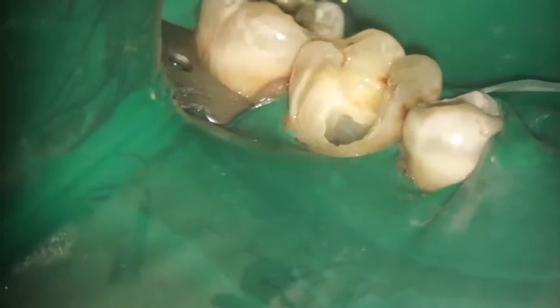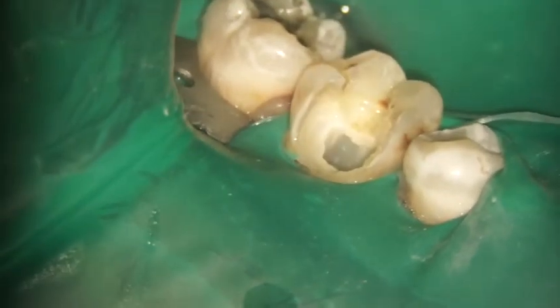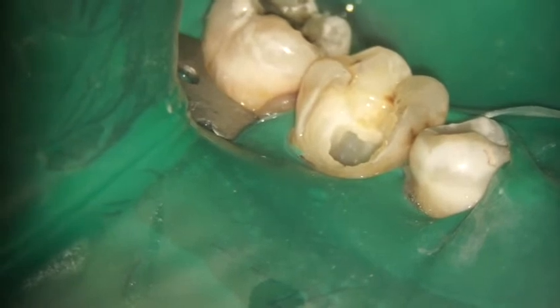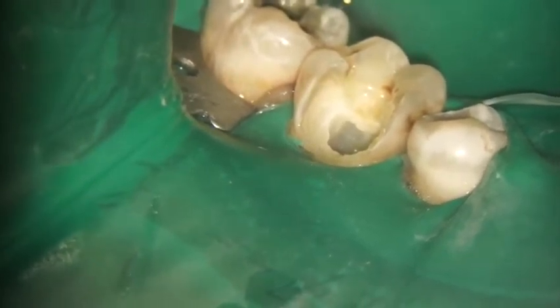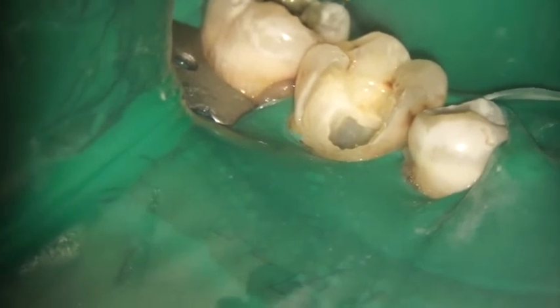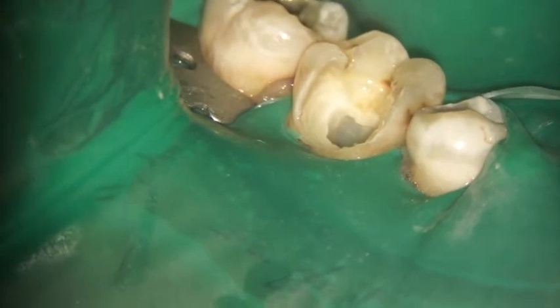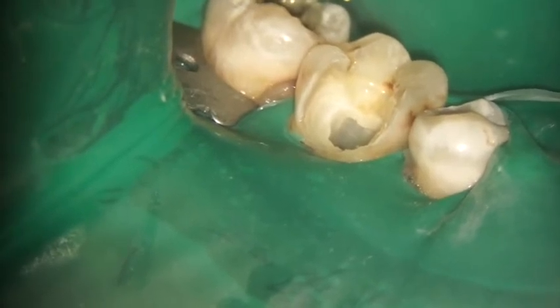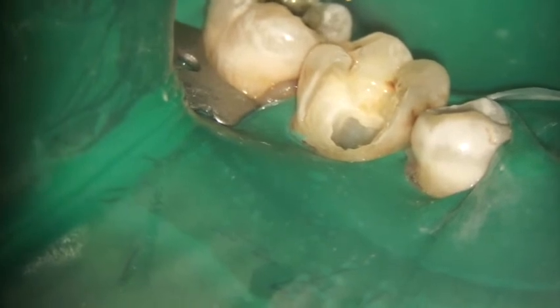Hey guys, whenever we do a truss access or constricted access cavity or even a caries driven access cavity, the pulp horns or constricted areas of the pulp chamber are most of the time forgotten. These areas can potentially lodge a lot of pulp tissue and necrotic debris. These things have to be taken into account and are supposed to be cleaned properly and filled sufficiently.